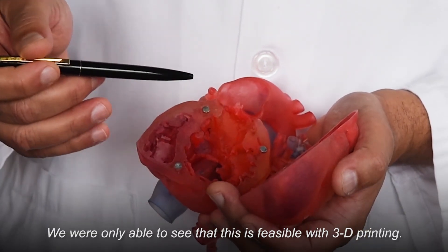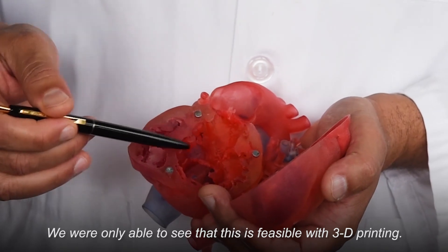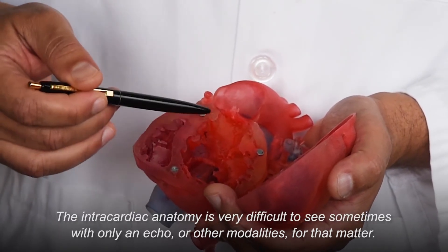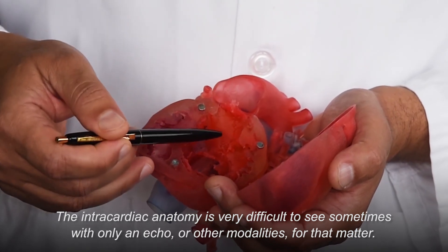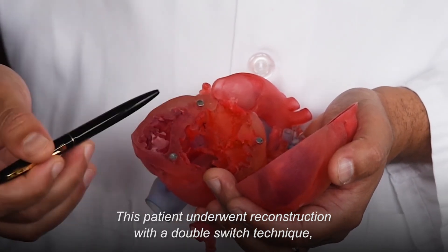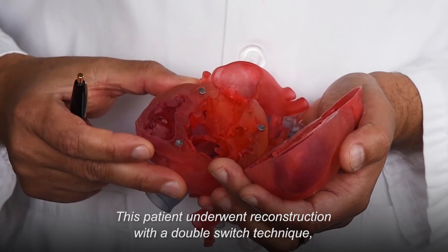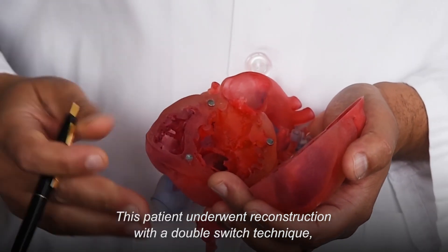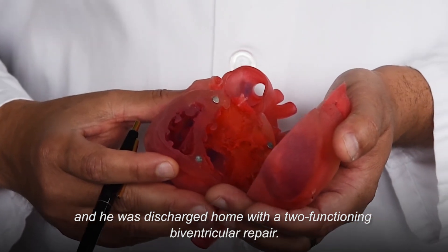We were only able to see that this is feasible with 3D printing. The intracardiac anatomy is very difficult to see sometimes with only an echo or other modalities for that matter. This patient underwent the reconstruction with a double switch technique and was discharged home with a two functioning biventricular repair.